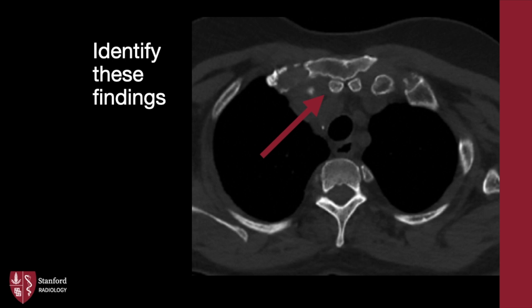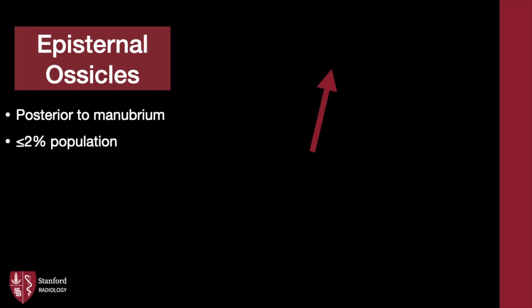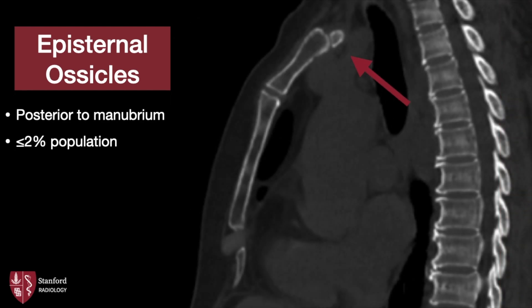Next case: what are these findings? These are episternal ossicles located posterior to the superior border of the manubrium. Like any ossicle in the body, do not mistake these for acute trauma. Here is how they look on sagittal view.